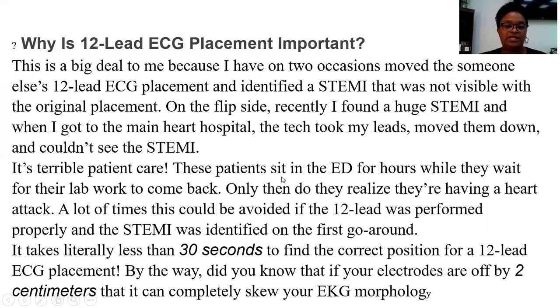So why is the 12 lead EKG placement important? This is a story that was shared by an EMT. And he says, this is a big deal to me because I have on 2 occasions moved someone else's 12 lead EKG placement and identified a STEMI that was not visible with the original placement. So you see right there why that placement is so important, because that patient could have actually had a heart attack. But if you didn't place those leads right, you won't be able to pick that up.